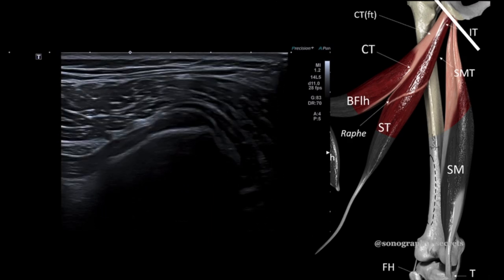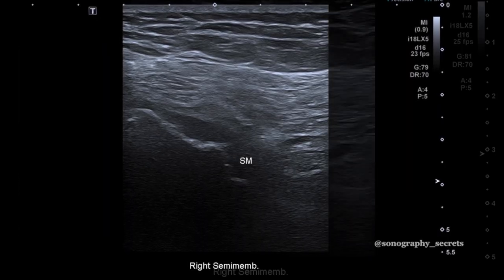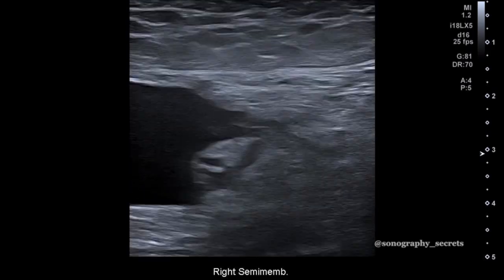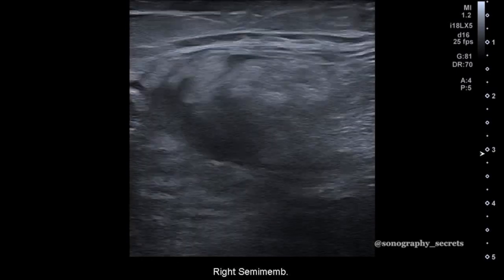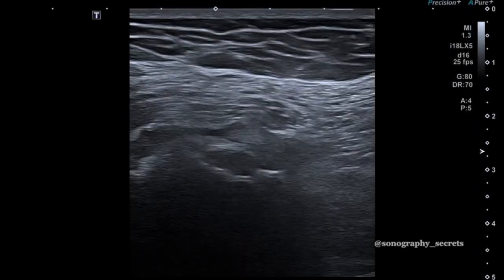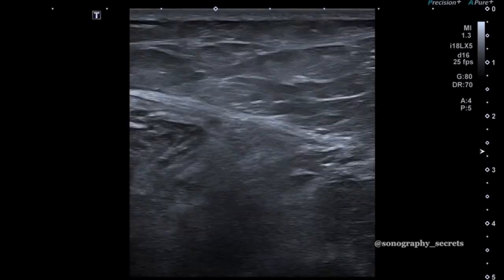Now, when we have a hamstring tendon rupture, it can be very difficult to identify any semblance of normal anatomy. It'll be replaced with hematoma, blood, and debris. But if we have that methodical and systematic approach, we get used to seeing what normal is, and we can compare it to the other side to help us show that in this instance, we've got a complete tear and retraction of the semimembranosus and conjoint component of the hamstring.